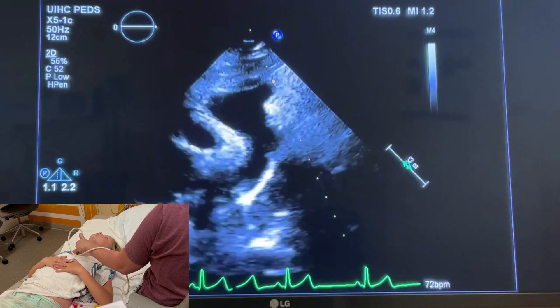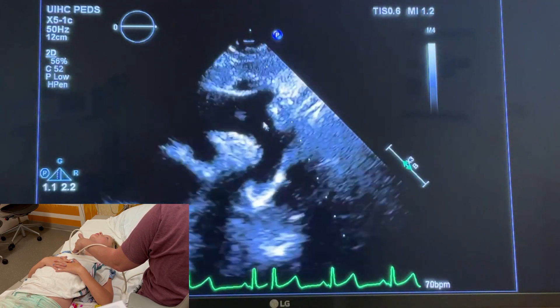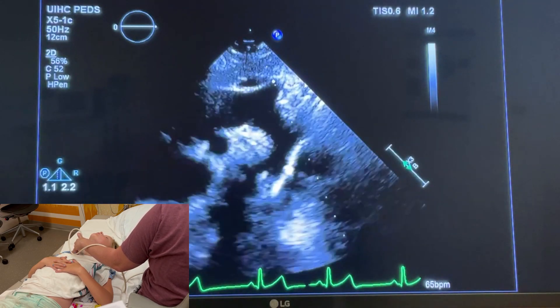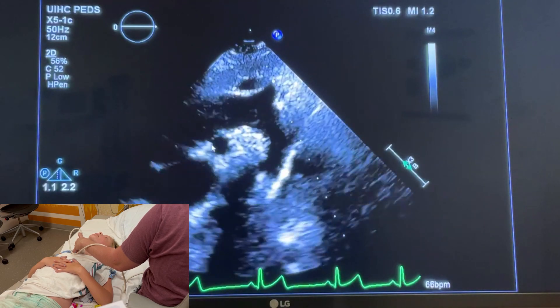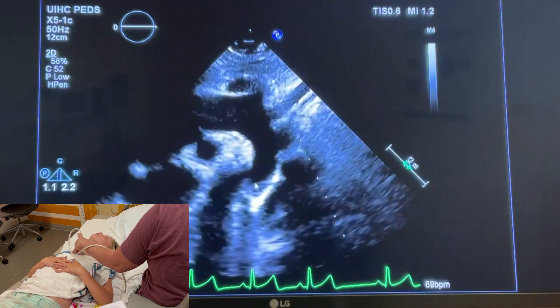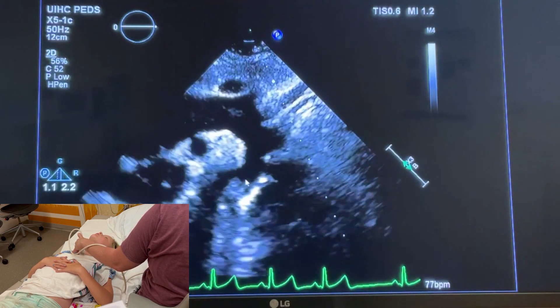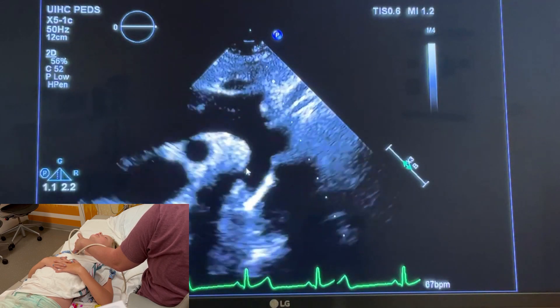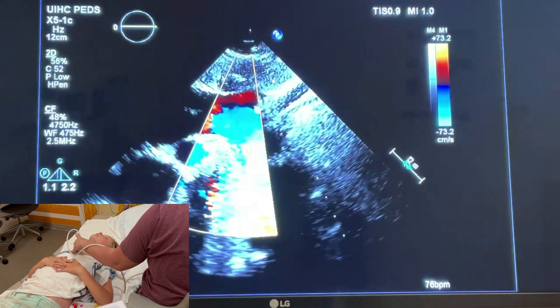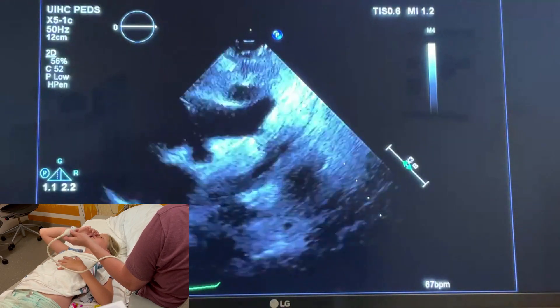With this view you can also demonstrate if there is a bovine arch — she has three vessels coming out so her arch is not bovine. With a bovine arch you'll see one common trunk and then two branches. Here is the right pulmonary artery, and here would be a coarctation site if there was a small isthmus. You can see hers is widely patent — this is the isthmus without a posterior shelf. If there was an issue with PDA closure, you might see a PDA come in on this view.